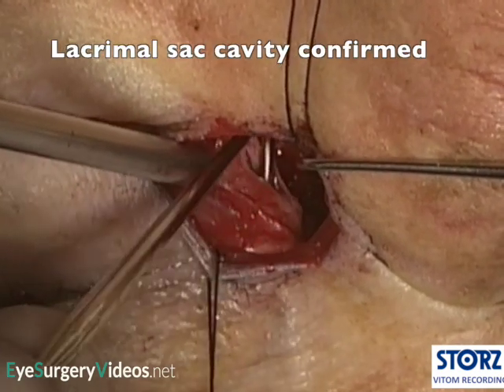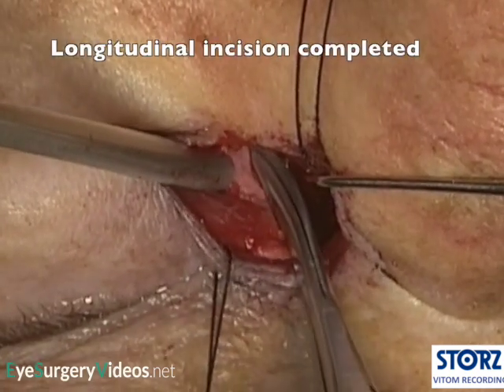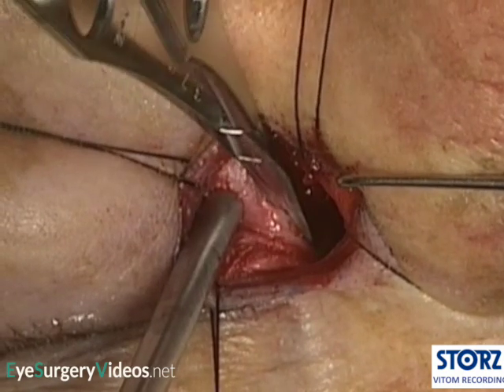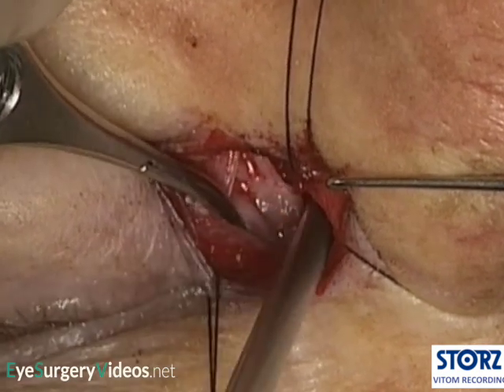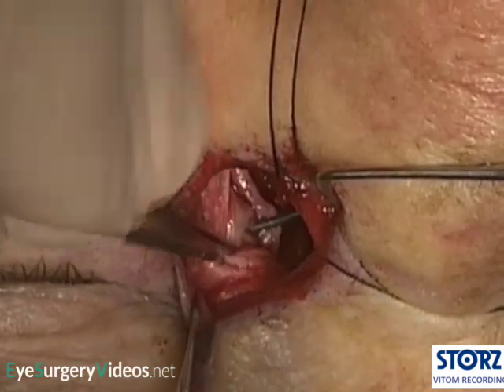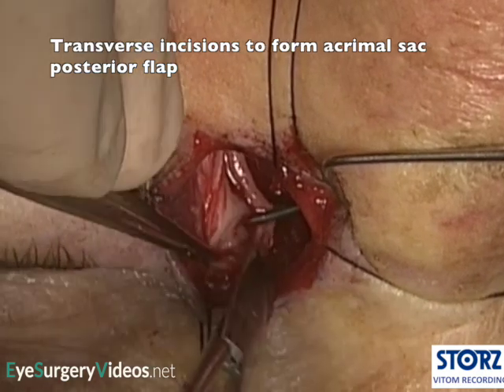With the lacrimal sac still tented up by the probe, a horizontal incision can be made in the superior-most aspect of the sac. A cataract surgery keratome is a very useful instrument for this, although a regular number 11 blade can also be used. Westcott's spring scissors are used to make the longitudinal incision down the length of the lacrimal sac, ensuring that adequate anterior and posterior flaps will be formed. Finally, a further horizontal incision is made at the inferior-most aspect of the sac. The probe should now be easily advanced and visualized.